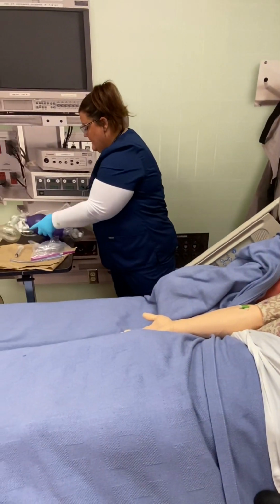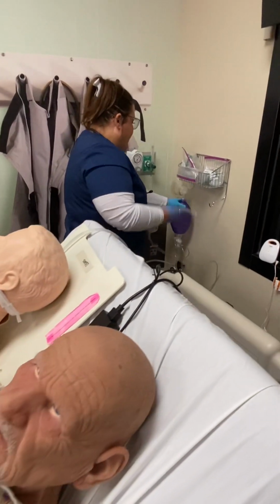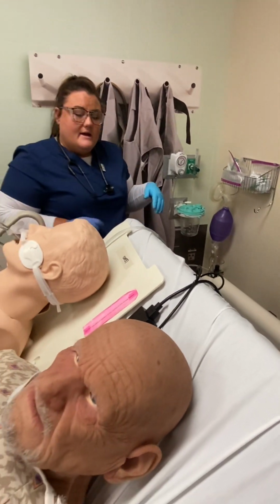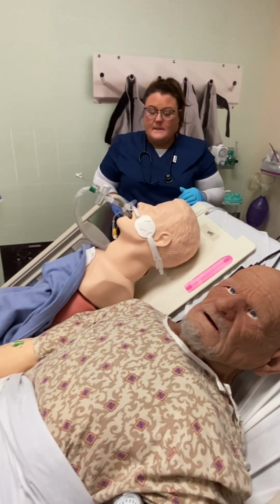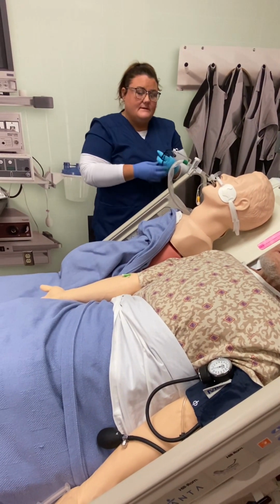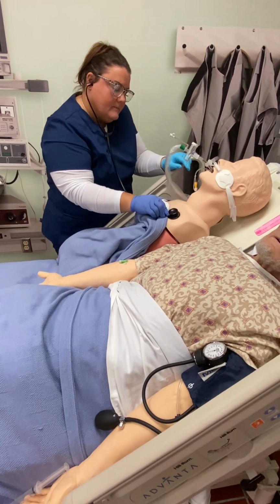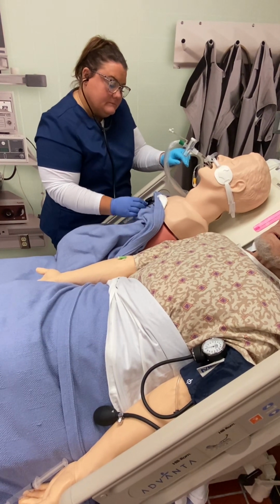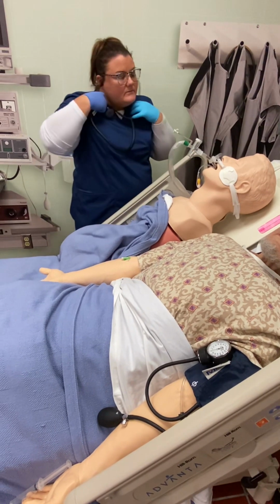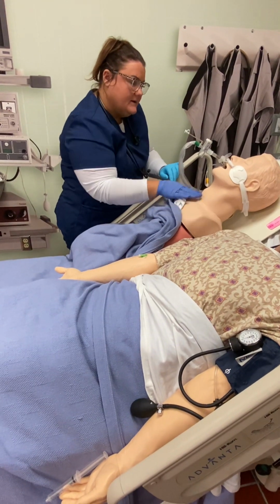All right, grab my blue bag, stick this at the head of the bed, and I would plug it up and flush it out. That way I have it ready in case we are ready to extubate. Okay, all right, Mr. Smith, go ahead and give you a listen. And I would listen to each segment for one full breath cycle. I'm also just gonna feel for any rhonchi.